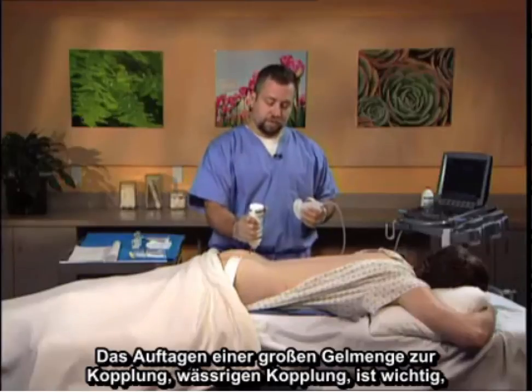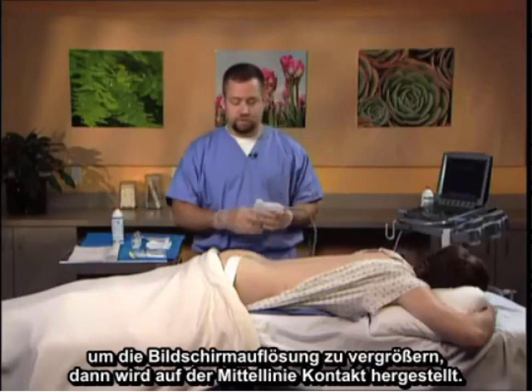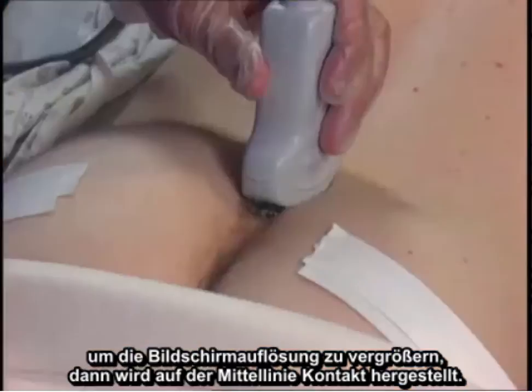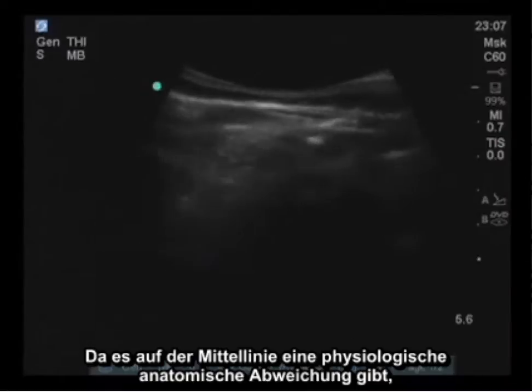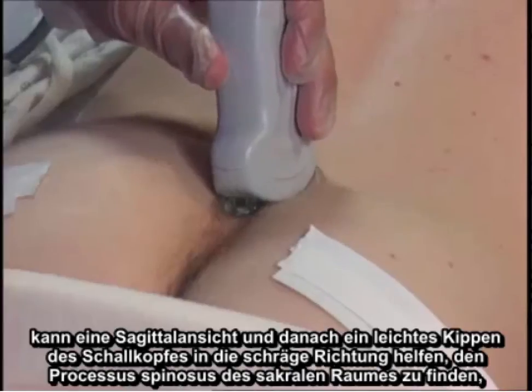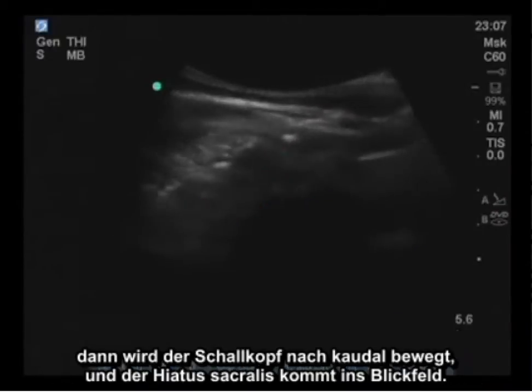Placement of a copious amount of gel for coupling, aqueous coupling, is important to enhance resolution on the screen. And then contact is made in the midline. Because there is anatomic variation in the midline physiologically, a sagittal view and then gently rocking the probe in the oblique direction can help find the spinous processes of the sacral space.